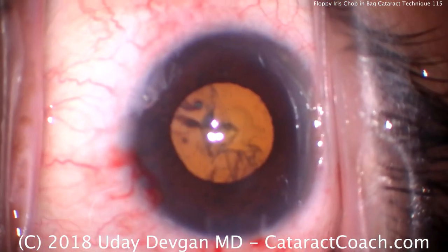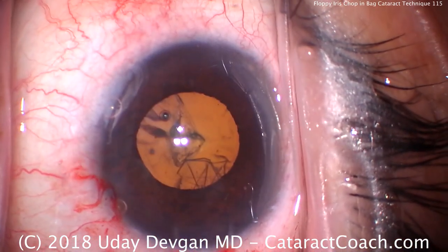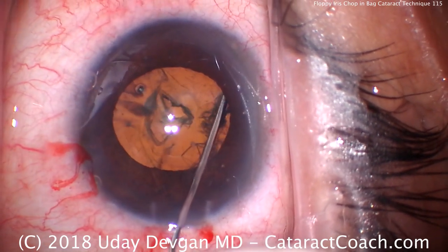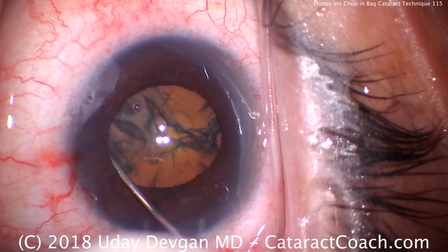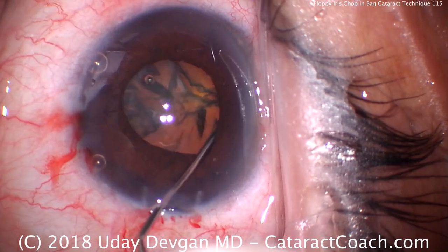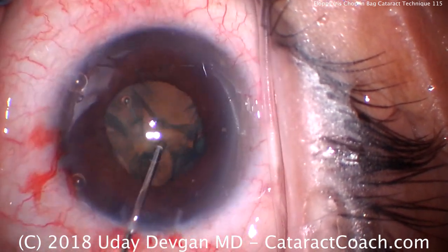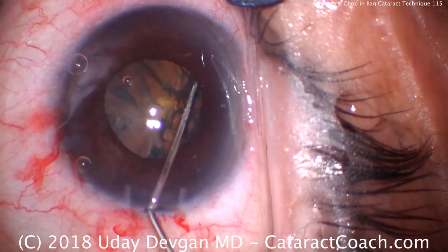This patient, of course, doesn't realize it's a tough case and just doesn't want to cooperate, but that's okay. Here's a balanced salt solution on a blunt cannula — a few fluid waves going across. We're not going to prolapse the nucleus out of the bag. This patient's a high hyperope. There's the iris already wanting to prolapse. High hyperope with a shallower anterior chamber, shorter axial length — there's not a lot of working room here. I don't think I can prolapse the nucleus out of the capsular bag, so let's leave it in the bag.